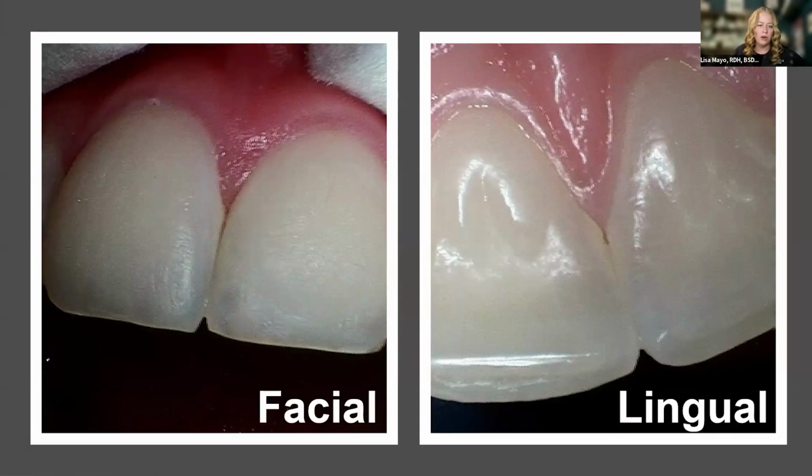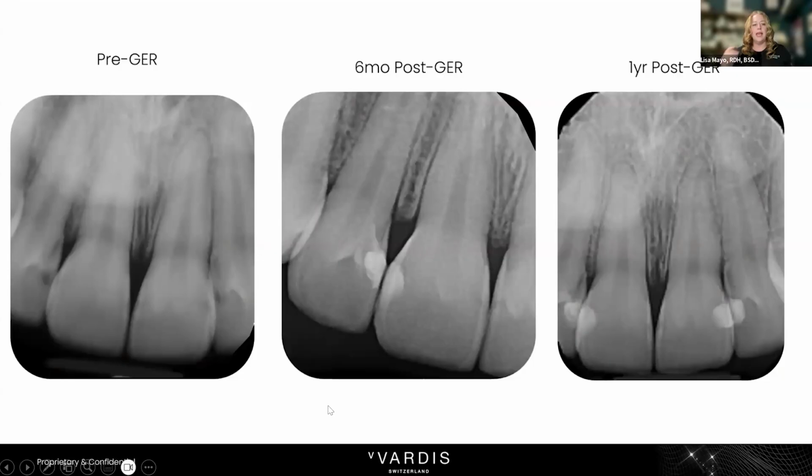From the facial, not too bad, but if you look at the lingual, look at the interproximal space between 8 and 9. If you take an explorer along that mesial of both those teeth, your explorer just jumps, jumps, jumps. I mean, you can just feel the demineralization and the decreased pH of that area. So, yes, I cried the day we found these lesions.